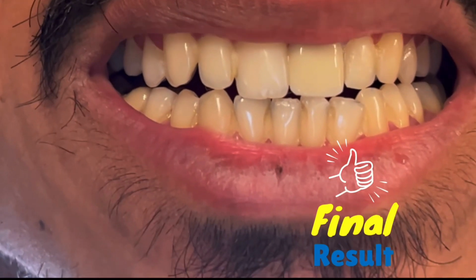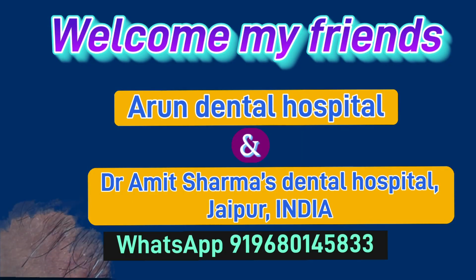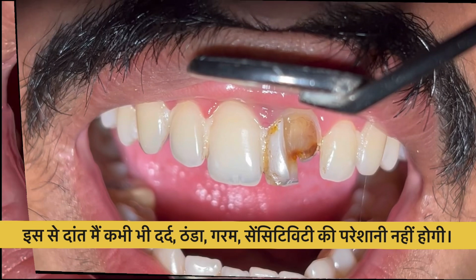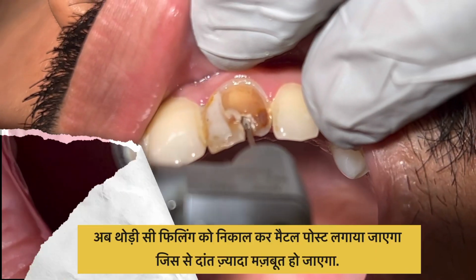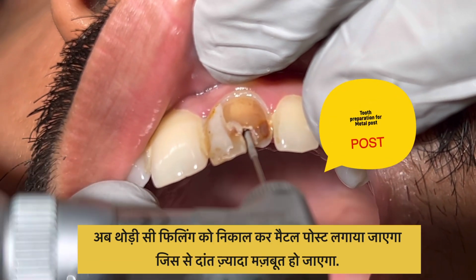So if you ask me what a dental post is, a dental post is a small rod-like structure used in restorative dentistry, particularly following root canal treatment, to support and enhance the stability of a dental restoration. Posts provide additional support, especially in teeth that have had significant loss of structure due to decay or fracture, and they help reinforce the tooth and increase the longevity of the restoration.